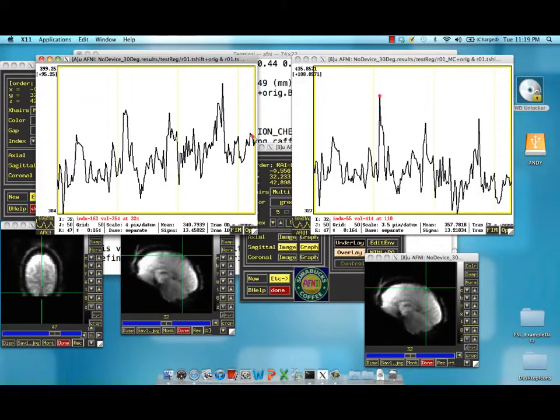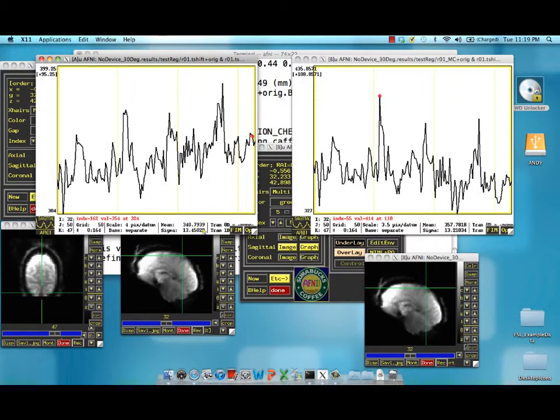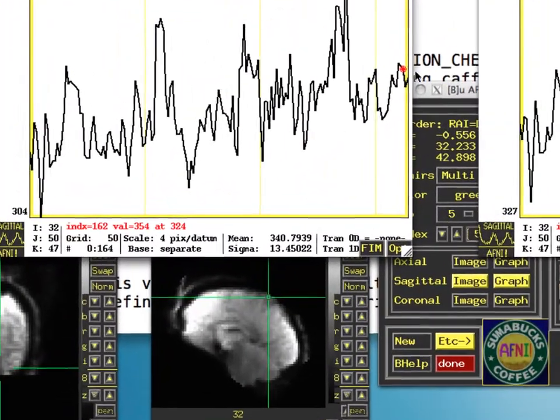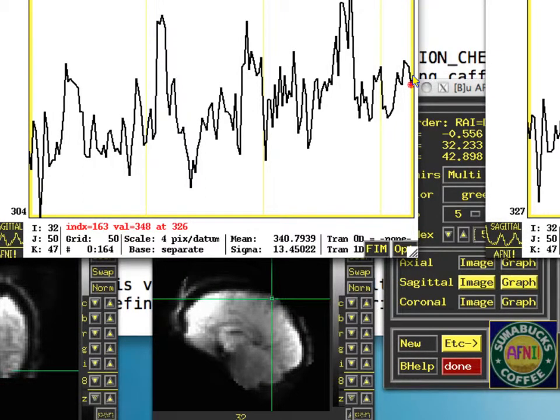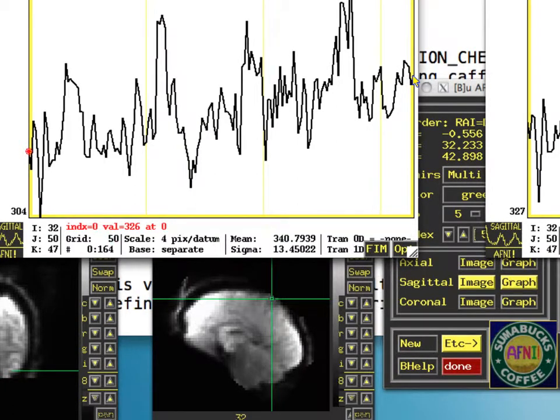Just to show you, this is the non motion corrected data set. And look what happens when I go from the very end time point to the very beginning.